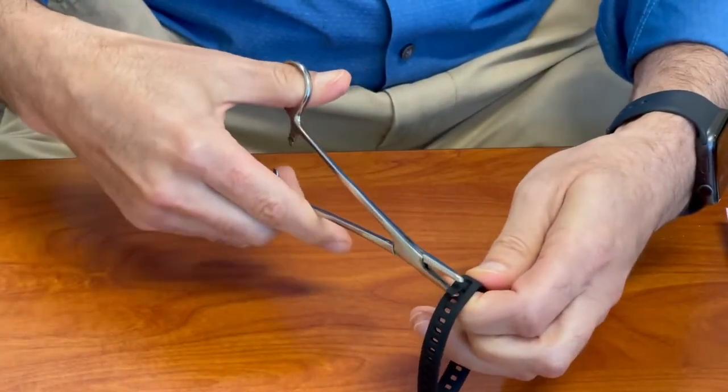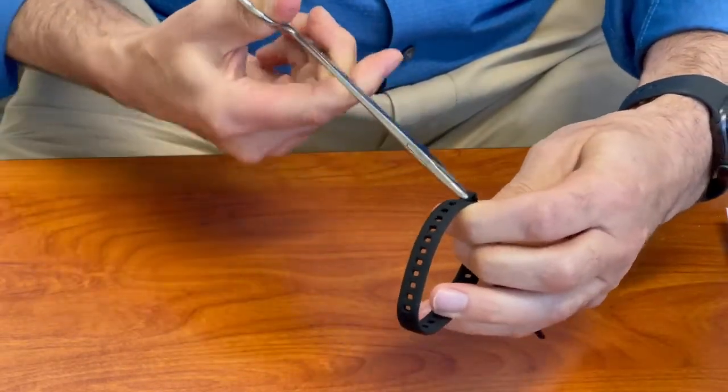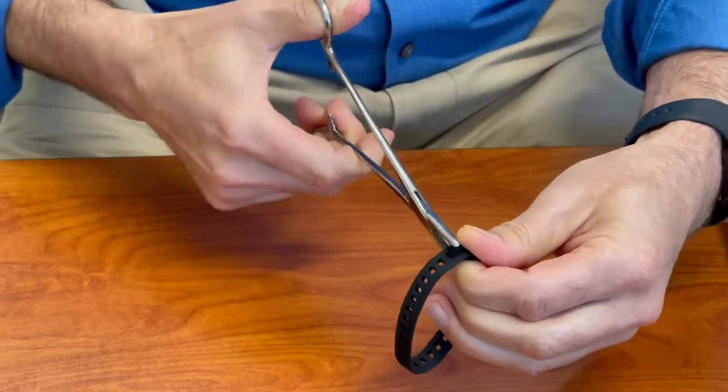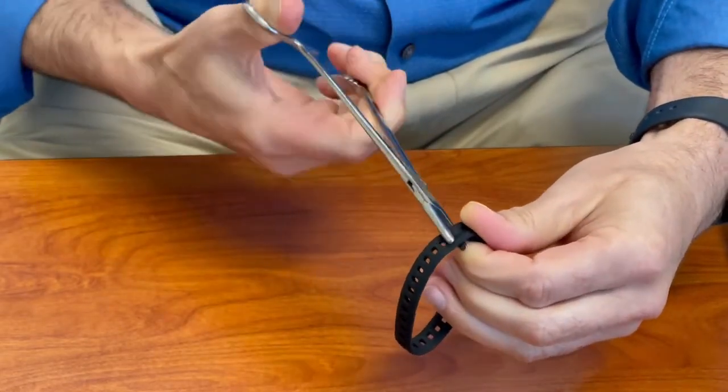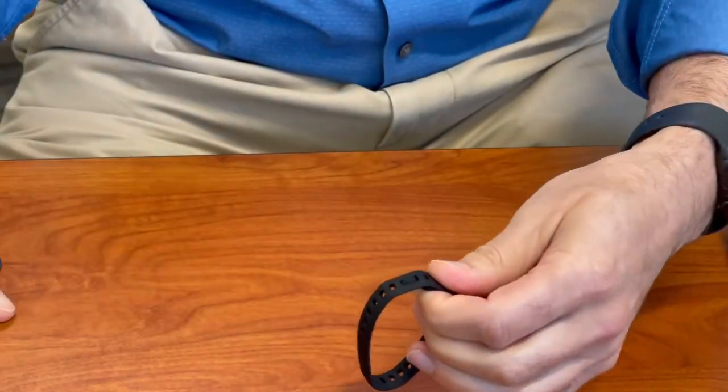We take, in this case, a needle driver, bend it down and place it through the adjacent perforation, pinch that down, smooth it out on the bottom, and that's the locking process.